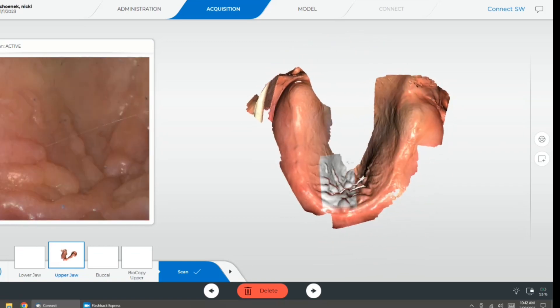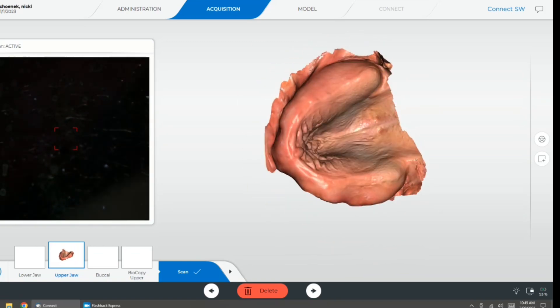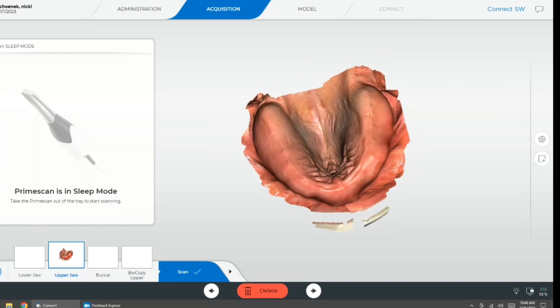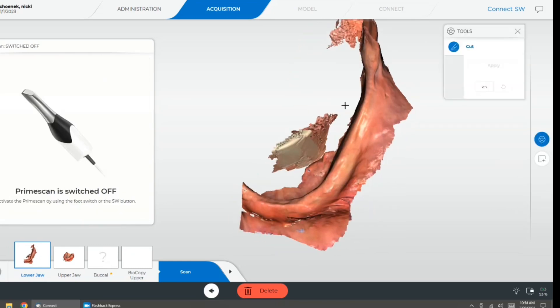Here I'm using an intraoral scanner to capture the soft tissue borders, getting the hamular notches and all the way up the buccal fold, making sure to capture my borders in one smooth movement with the optical impression.